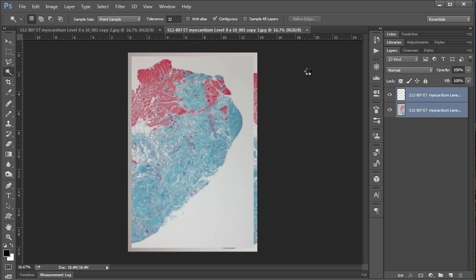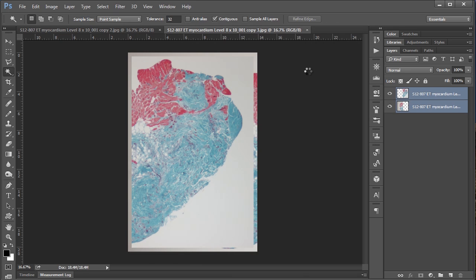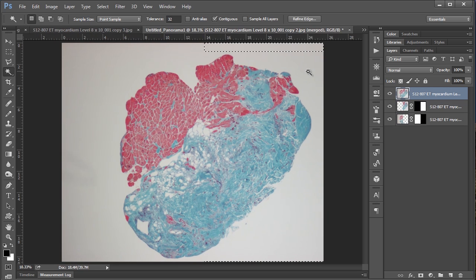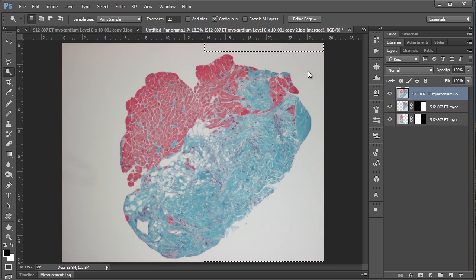And so now what Photoshop is doing is basically taking these two images and comparing them and lining them up. So that they overlap with each other. And I should mention that when you're taking the images you want to make sure that there is some overlapping region between the two so that Photoshop has something to work with.